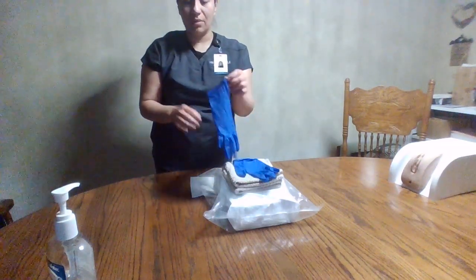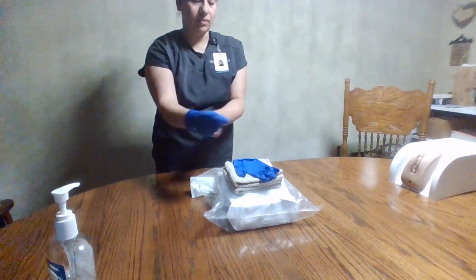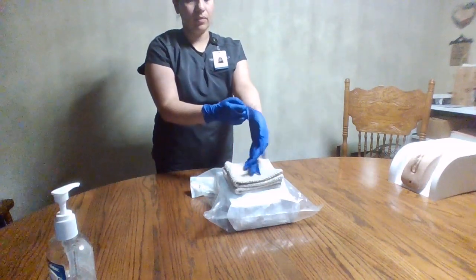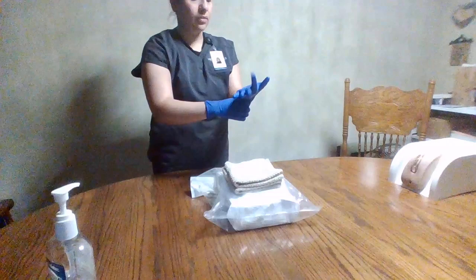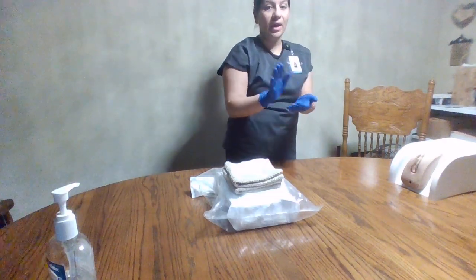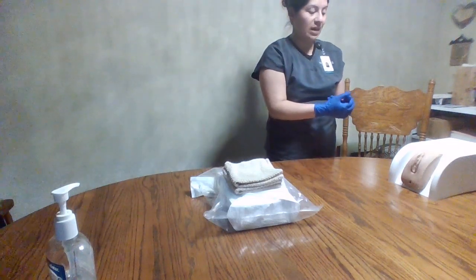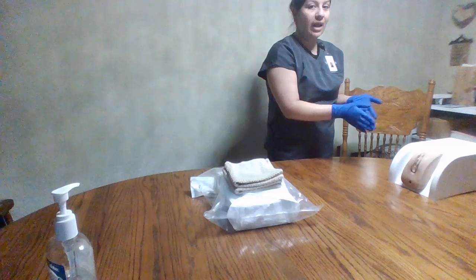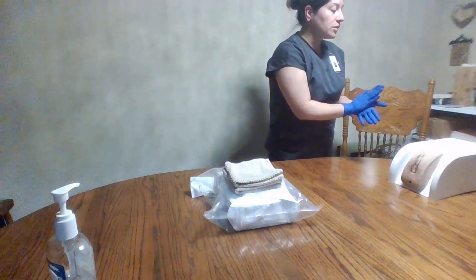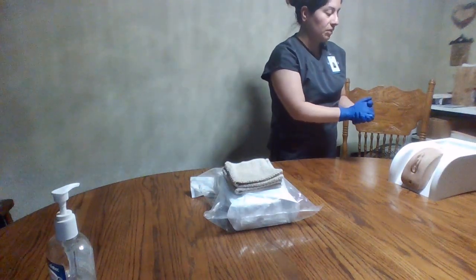I will begin by donning clean gloves. Now I am dominant in my right hand, so I will make sure to be at the patient's right side. I will lie the patient flat. So Mrs. Smith, I am going to lower the head of the bed just to make sure we have you in a lying flat position.